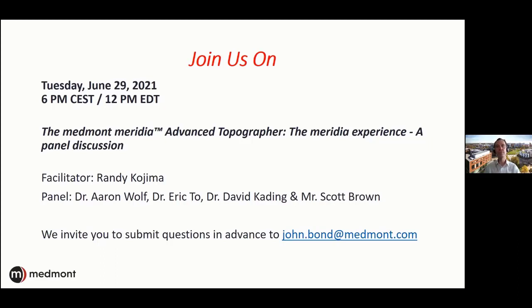So we have another question, and it is, does the Medmont Meridia have any grading software for meibomian gland loss? So it certainly has the ability now, and this is quite a new function, to put up a grading scale against your image. So you can do a direct grading. Obviously, that's still a subjective grading. And I know that we're working with the team to see whether we can get more objective grading from the instrument as well. There are not many instruments that do that, and certainly not that do that well. So that is the next step in terms of software development.